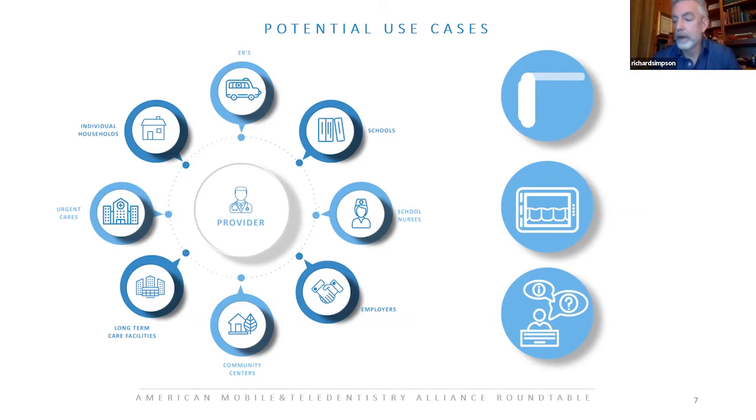Thanks, Bill. Yeah, Bill did a beautiful job in covering a lot of this. I did want to expound on this just a little bit. And obviously, anybody attending this meeting tonight is well aware of where dentistry is and the trend in moving beyond the traditional brick and mortar.